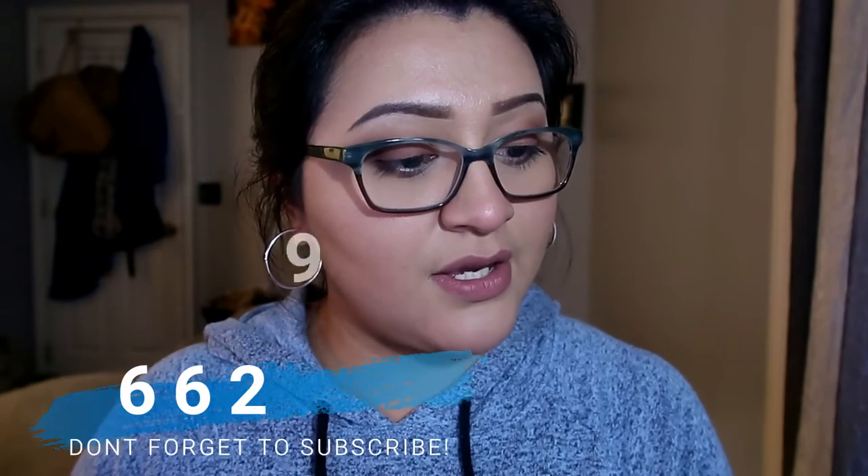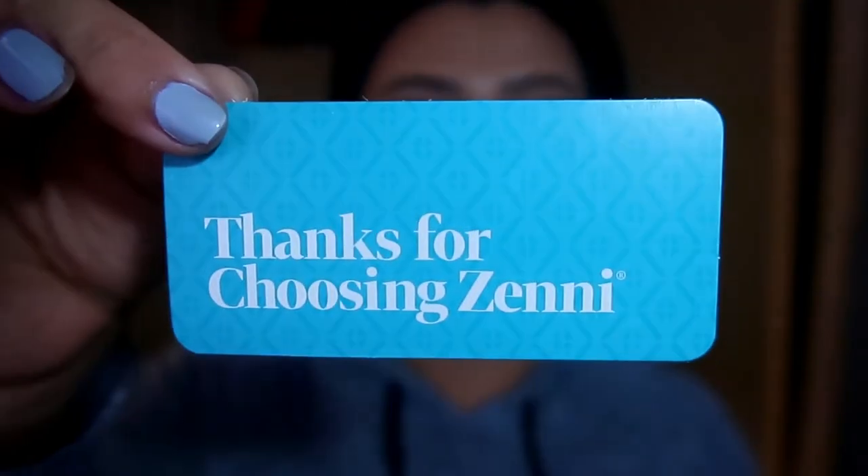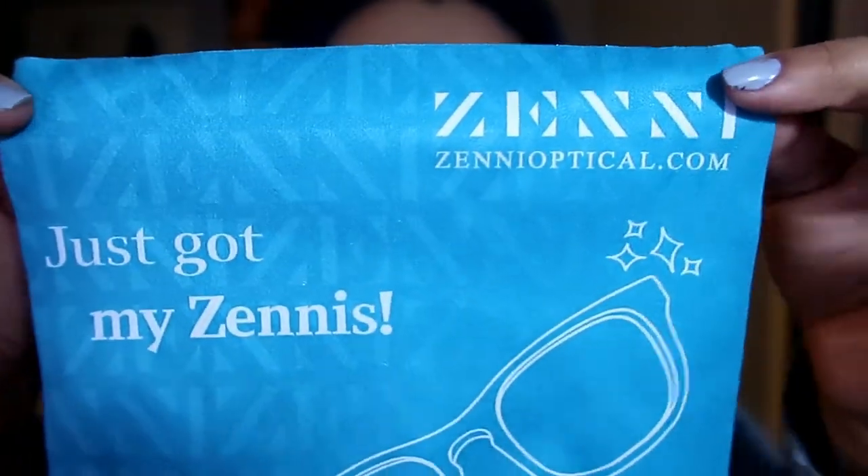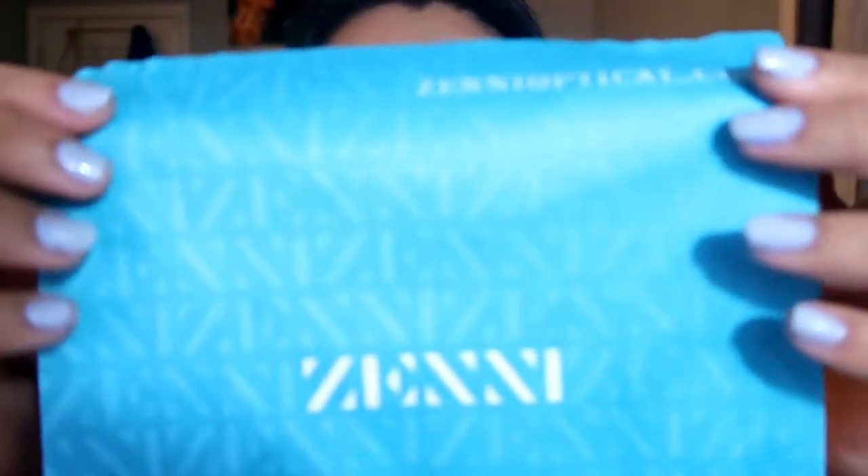So this is my order number here. I believe the frame number is 662919, so I'll put that on screen for you. It also came with a little card that says thank you for choosing Zenni. And it's wrapped in a really nice Zenni cleaning cloth — it says 'got my Zennies' on the cloth, and it's teal again. Really, really cute, with their logo on the back.